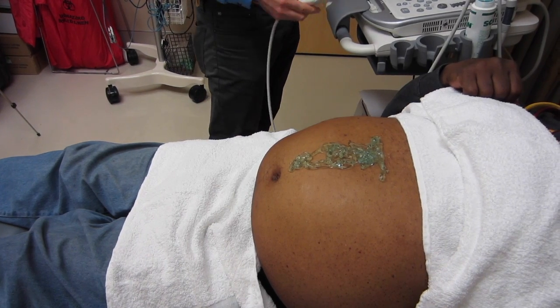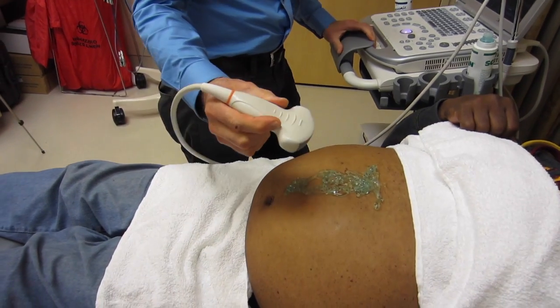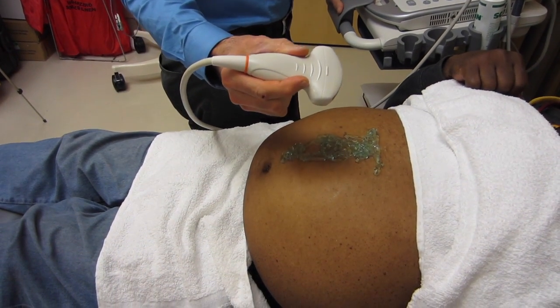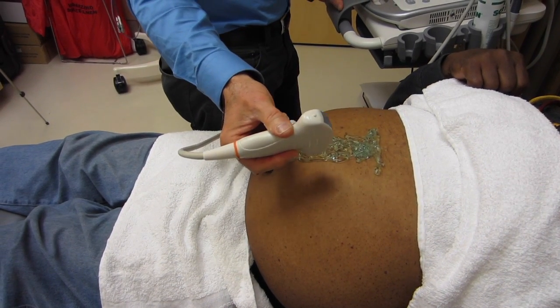Select the curvilinear probe. Have the marker facing the patient's right-hand side and start at the xiphoid process.